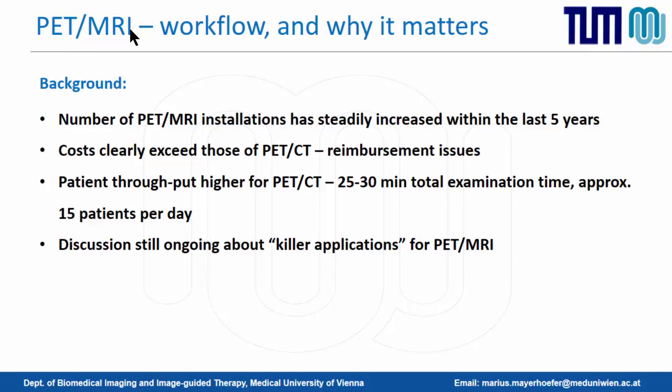So, when we talk about PET-MR workflow, we have to ask ourselves, why does it even matter? And that's actually quite easily answered. We all know that the number of PET-MR installations has increased, in particular over the last 5 years. The problem is, when you compare it with PET-CT, the costs clearly exceed those of PET-CT, which in many countries can cause some reimbursement issues, not in the country that I come from, not in Austria, because everything gets reimbursed, sort of, but for instance in Germany there is a different situation.